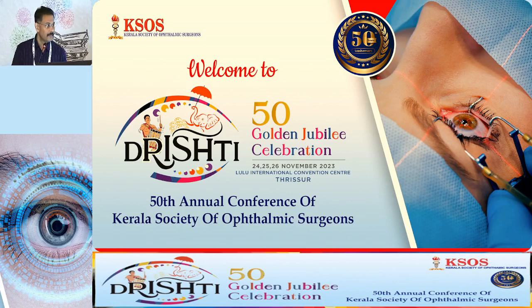Thank you, sir, for that excellent talk. Sir, I want to ask one question. If there is a DM tear at the clear corneal wound before the start of phaco, what strategy would you use, sir? Such DM tears happen as small flaps. Small flaps, so with small flaps, definitely you can watch and go in.